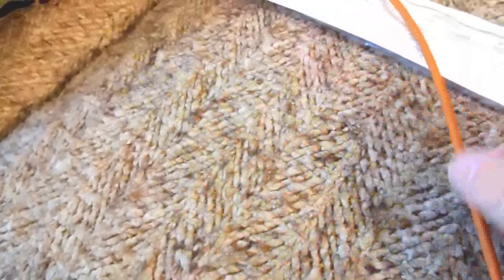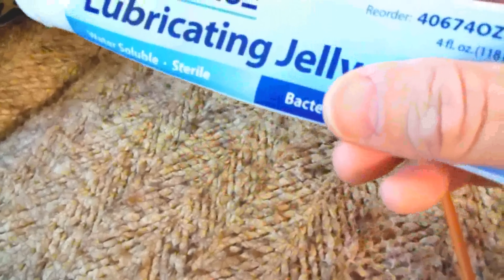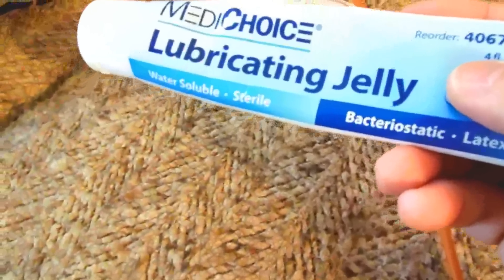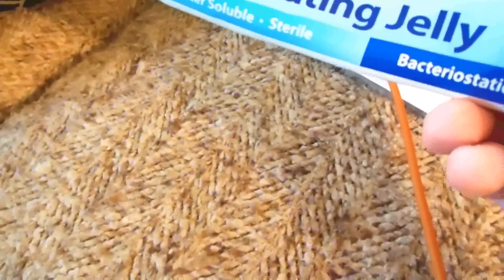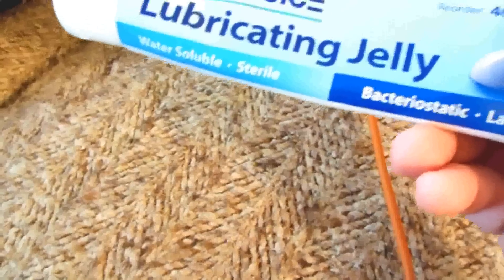This is not as bad as you think. You use a lubricating gel — this is a sterile surgical-type gel. If you had no choice, the regular kind you get in a store will work too. In a real emergency, nothing you can do about it. By the time I waited hours in the emergency room, I could have done this in about three minutes flat.